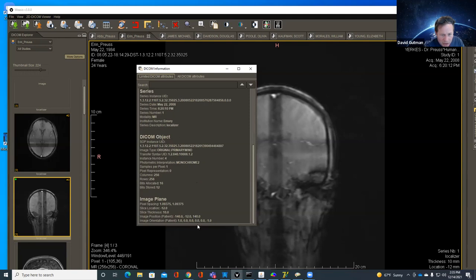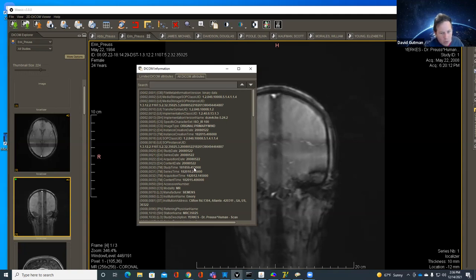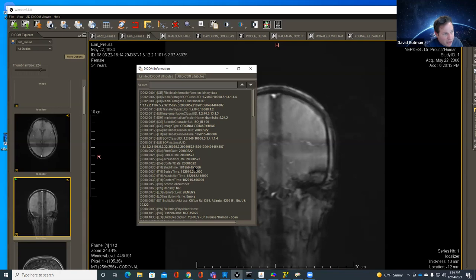Looking at the DICOM attributes: there are lots and lots of tags. Some of them are public tags where there's some key-value pair and I should have some idea what it means — series time is probably a time. But there are also completely private tags used by vendors with all sorts of properties related to image construction beyond my level of expertise. Sometimes if you nerf them because you don't know what they are, you make the data useless.